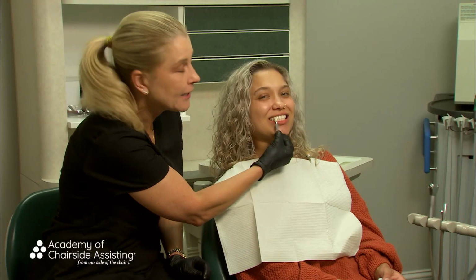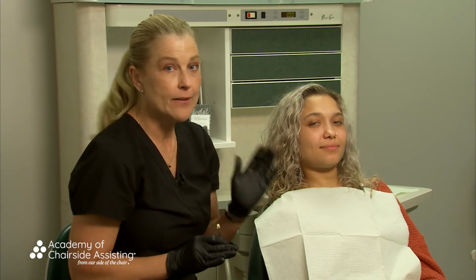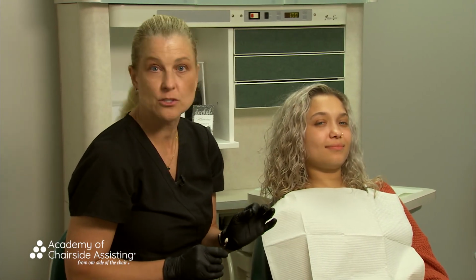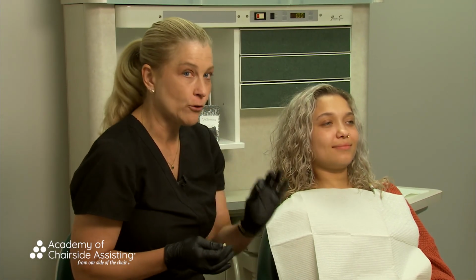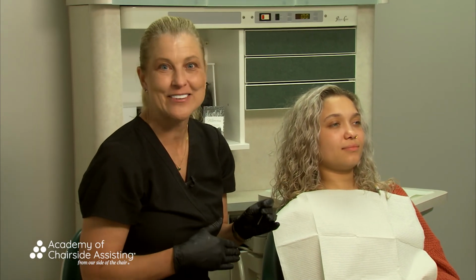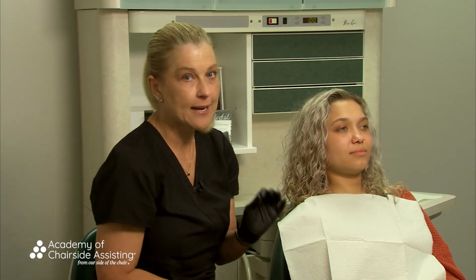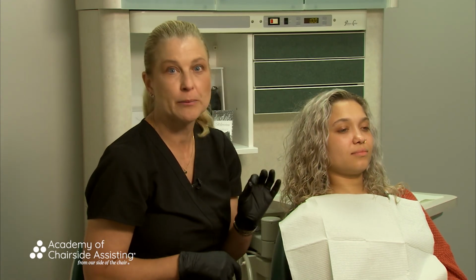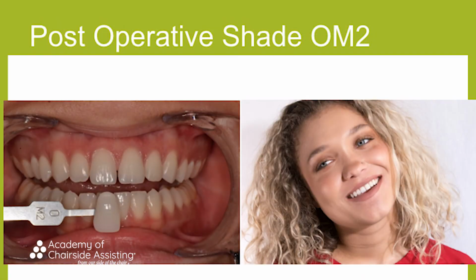So when we look at where Haley was, and again in just 20 minutes, that's a really, really good sign that we know that she is going to achieve some amazing results. Again, those home care instructions: every day for 7 days, don't skip a day, but it's just 20 minutes. That's nothing. Just really making sure, again, if you're the person that's going to be delivering that instruction to the patient, I also want to schedule them in 7 days. I want to make sure that they do it. And again, stressing the fact that 20 minutes a day, every day, don't skip a day, and we're going to see some really good shade change. And I'm excited to really be able to share that with you when Haley comes back here in just a few days to show you that really nice before and after.